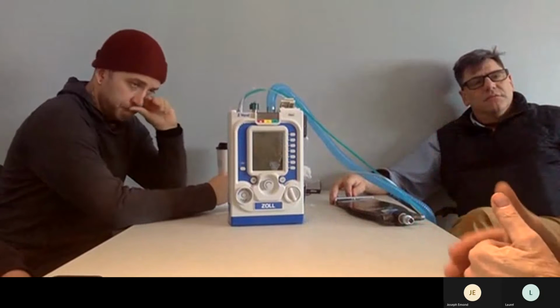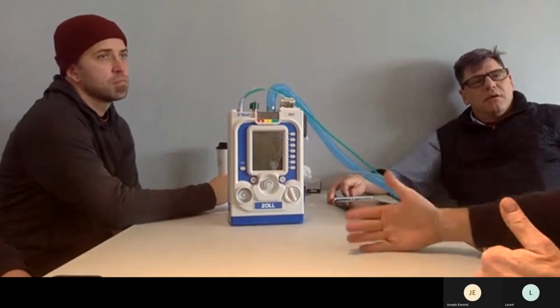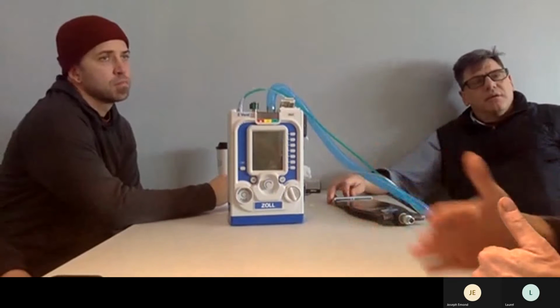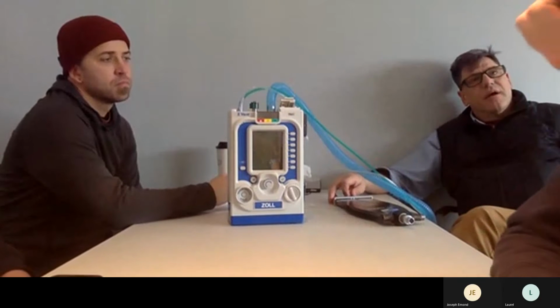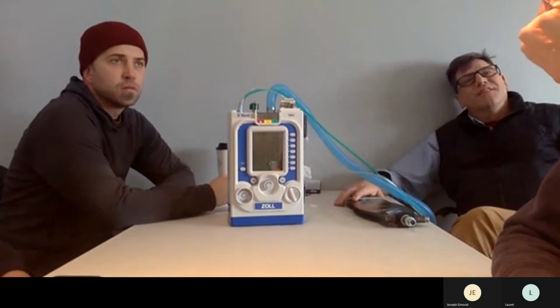So you want the number to make up the difference. That's confusing to some people. Right, like they see 5/5 and they go, oh, that's CPAP. No, that's 5 plus 5 is 10/5. Correct. Now let's take the next step. Real quick, 0/5 would be CPAP. Okay, just double checking, make sure I understood.